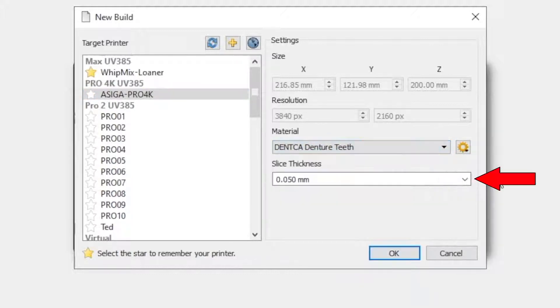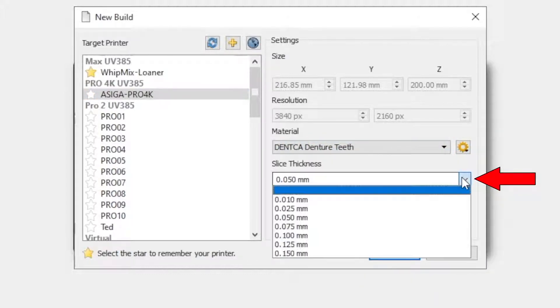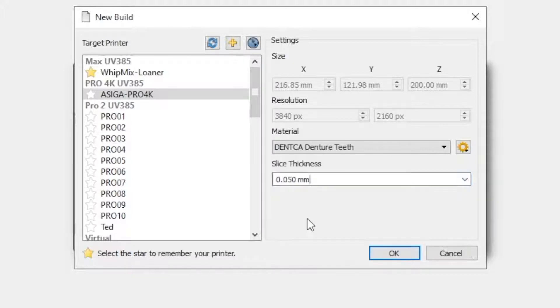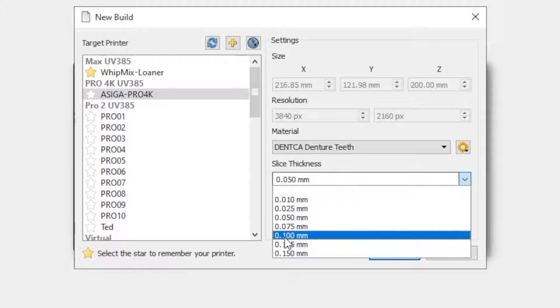Select the layer thickness to print. 50 micron layers will take longer to print but will have higher surface quality and resolution. 100 micron layers will be faster but will have lower quality surface detail. Select your thickness then hit OK.